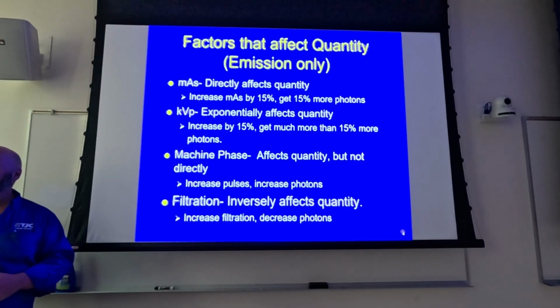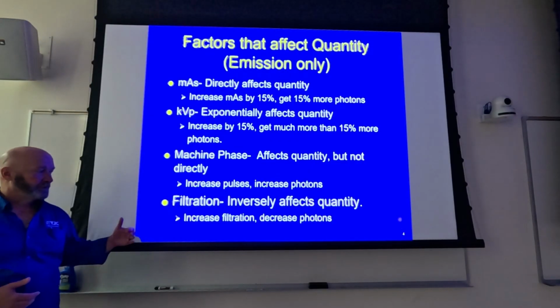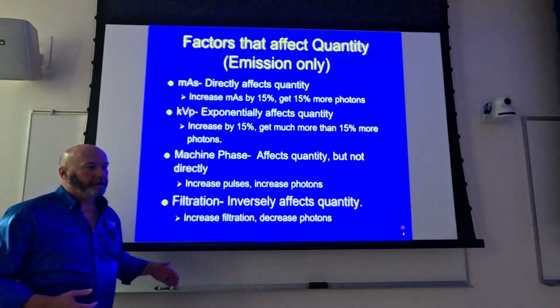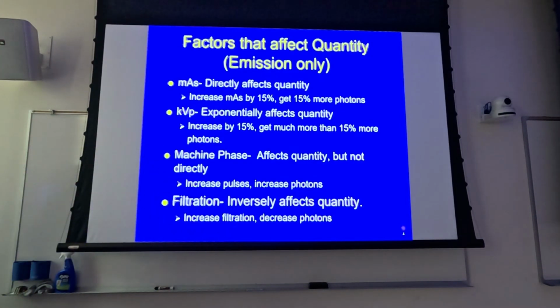It's increased inherent filtration. What it does is it inversely affects quantity: increased filtration decreases photons, but it increases overall quality.